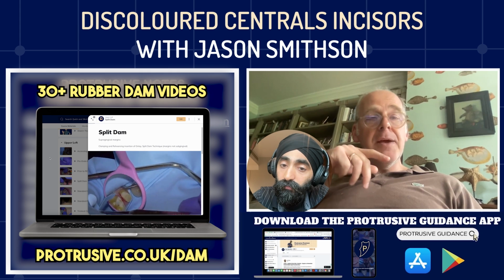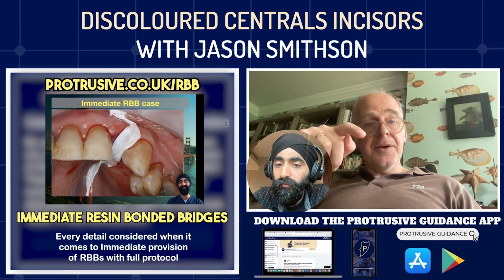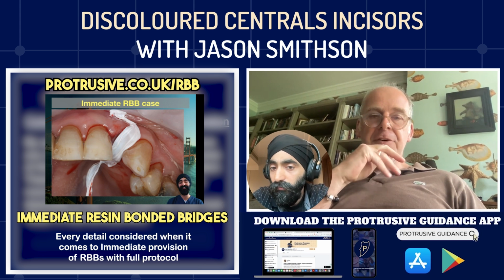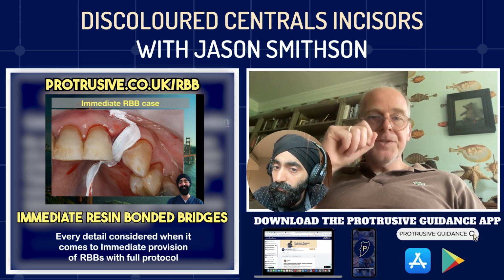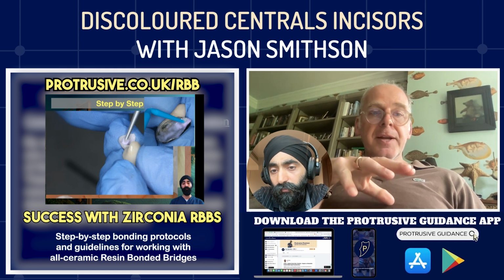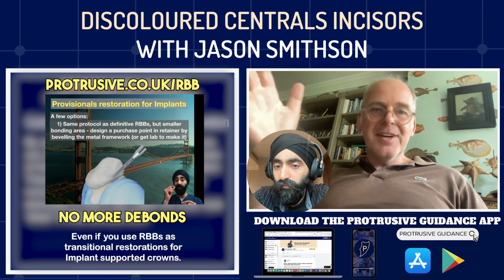Now you can get away with it a little bit more with composite resin at the cervical by using a lot of flowable opaque. So you could do less prep and use more flowable opaque. The only downside, and if you look at mine, I'm guilty of this myself, they look a bit dead in the gingival third because there's not so much regular composite resin and there's a lot of flowable opaque. The reason I've done that is to mask it and to get value or brightness and to lose chroma, lose color. But the trade-off is it looks a bit dead. And if a patient has a low lip line, you can kind of get away with that.